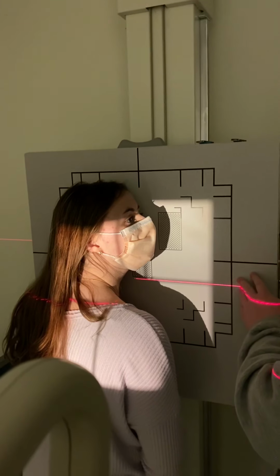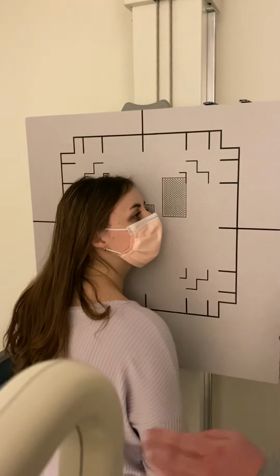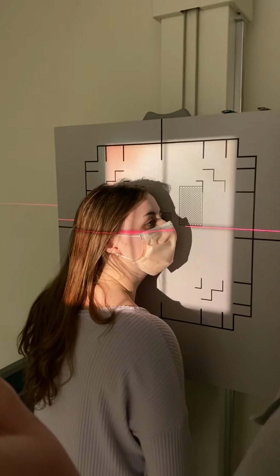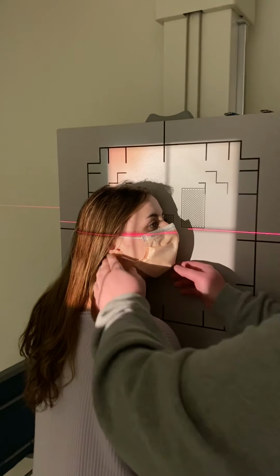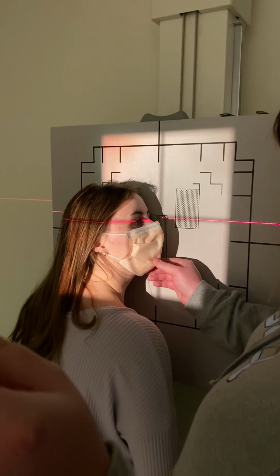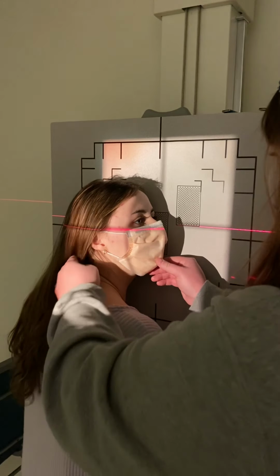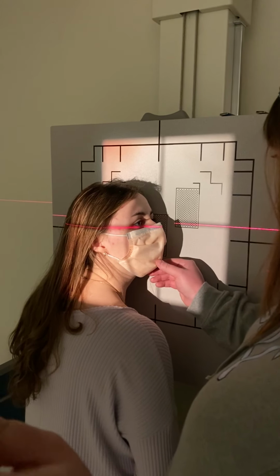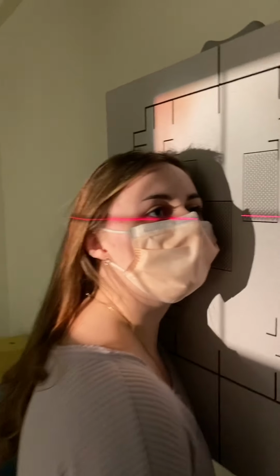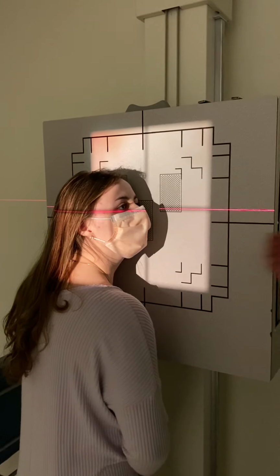I want to line that up with the center of my board, and I want the outer canthus to be in the center. My central ray is going to be perpendicular running through the outer canthus. So I'm going to line it up a little bit higher. Scoot forward for me just a little bit. If we look right at Bailey, we can see that her IPL is perpendicular and her IOML is parallel.